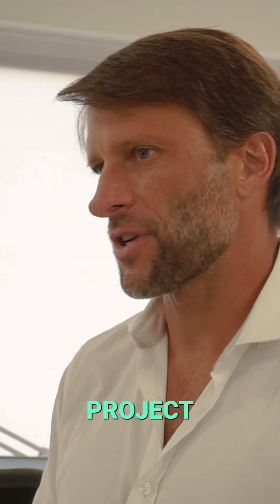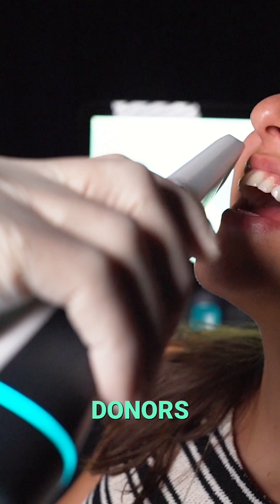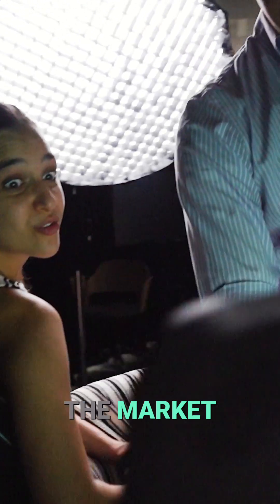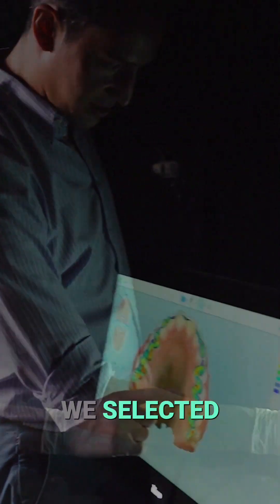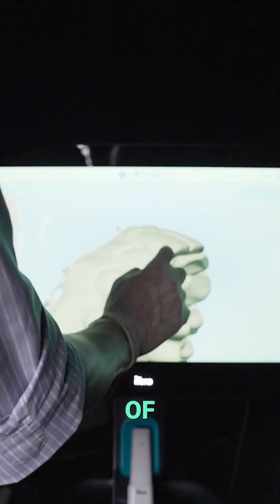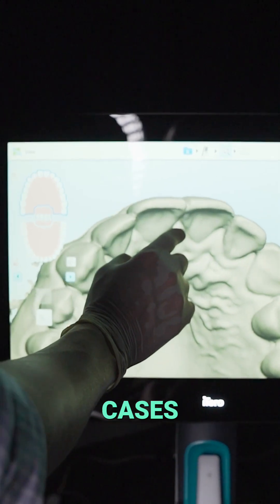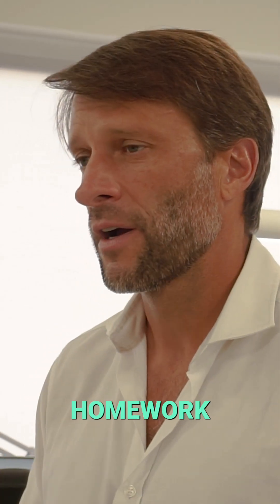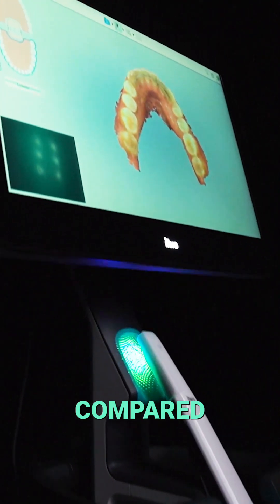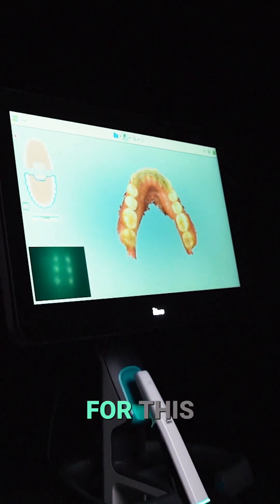The key of this project was to select the ideal smile donors and select the best available scanner in the market. We selected donors with beautiful natural dentition to cover all types of morphology and tooth age that we need to design all our cases. We also tested all the major scanners and compared the resolution of them to choose the best one for this project.